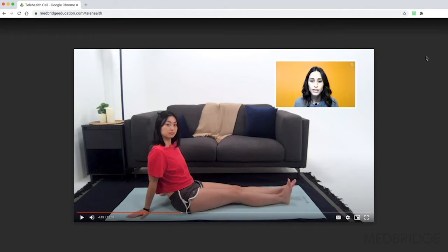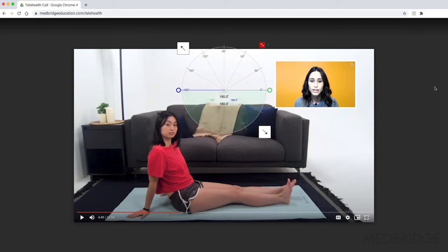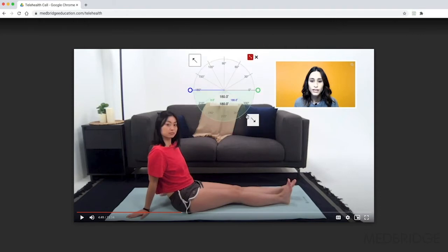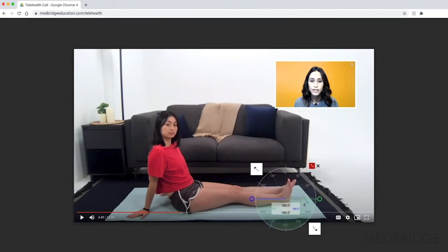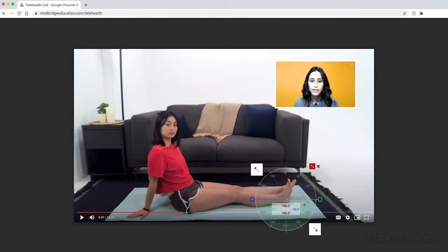In order to do this, you'll need to open your telehealth visit in a Chrome browser, open the protractor extension, and size the protractor tool appropriately. Click the arrows to move the tool, align the protractor with the associated landmarks, make a measurement, and document your findings.